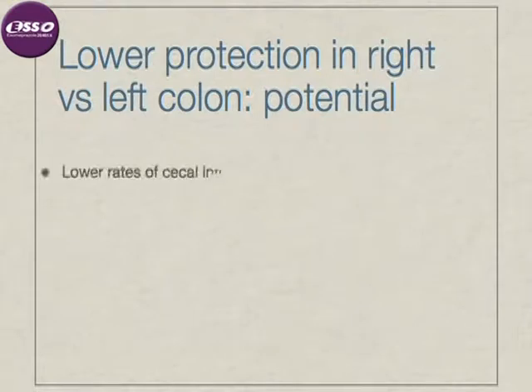First, some doctors have lower rates of cecal intubation, and some may say they have achieved cecal intubation when they have not. Thus, current guidelines for colonoscopy quality recommend minimum thresholds for cecal intubation and recommend documentation of cecal intubation by notation of landmarks in the cecum and photography of visualized landmarks.